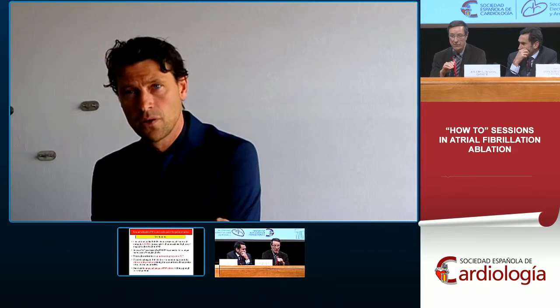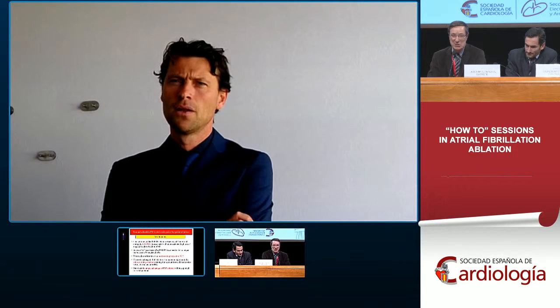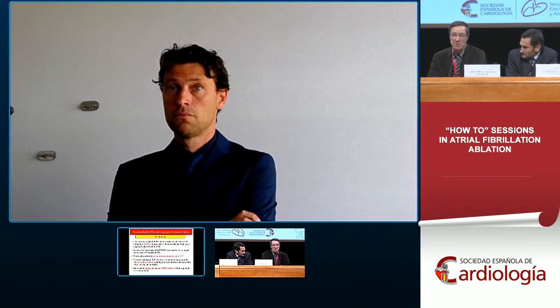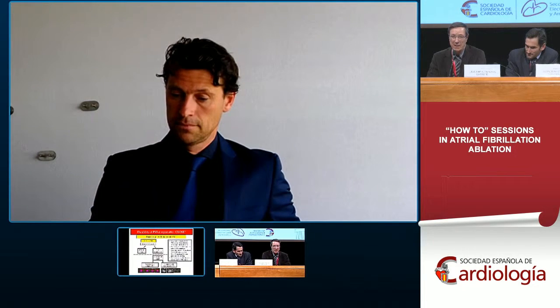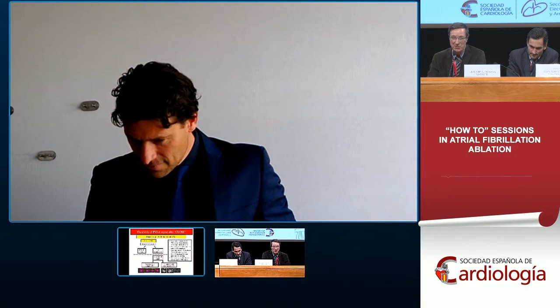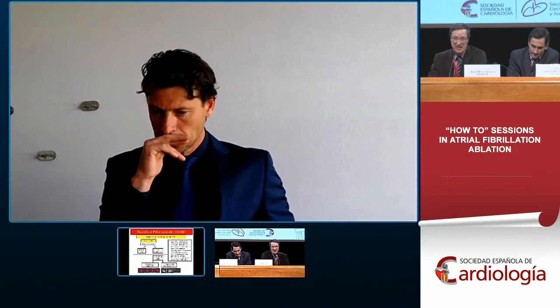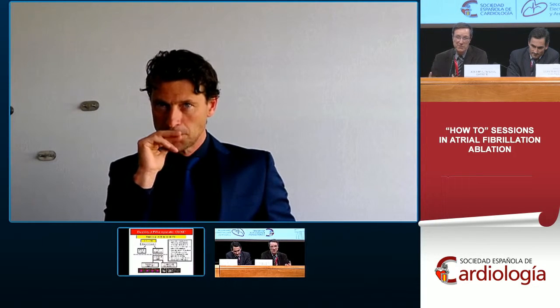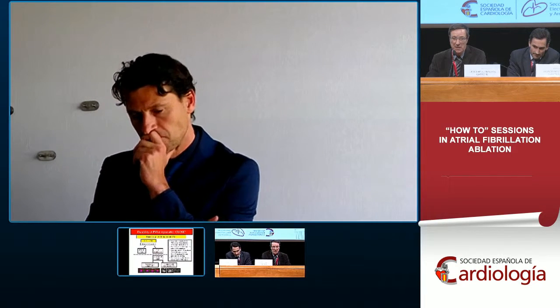Mattias, I have one question for you. Any lessons from the 3 patients in whom you saw PV reconnection? For example, in our experience, one area in which we see reconnections is in the roof, particularly in the roof of the right superior pulmonary vein. So we feel that sometimes if the catheter is less stable, which is something different from other parameters that we can measure, that could make a difference.